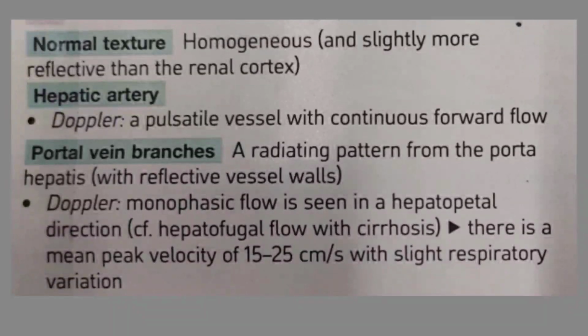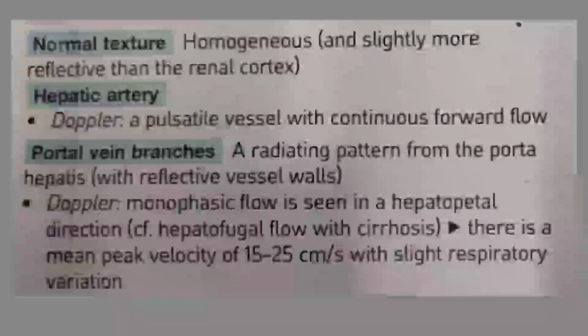As you know, ultrasound picks up all the soft tissue within the abdominal cavity, and intra-abdominal organs can easily be scanned by ultrasonography. Due to density difference, echogenicity difference, and different shape, organs can be visualized.